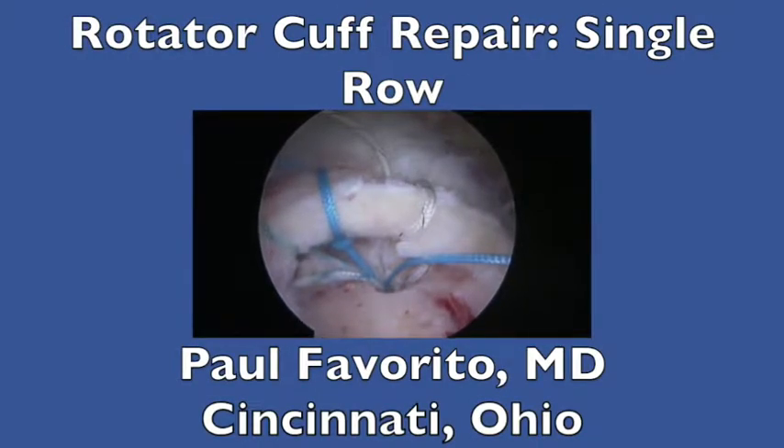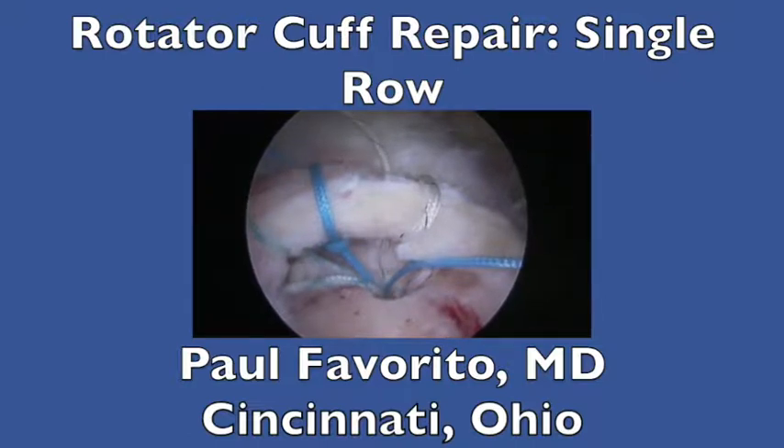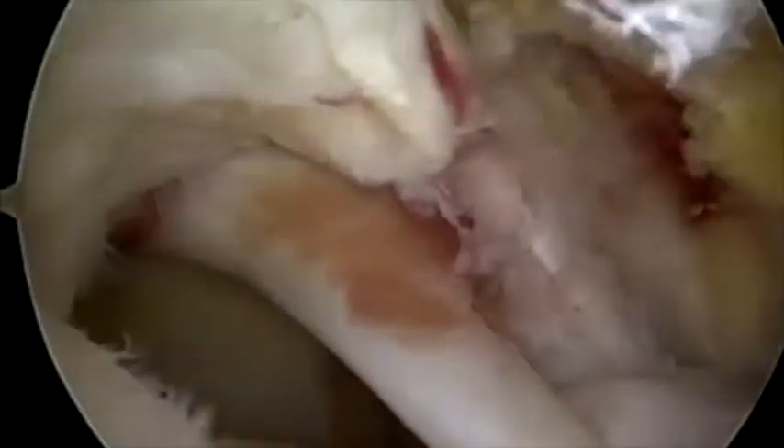This video will demonstrate the arthroscopic repair of a rotator cuff tear using a single row technique. The procedure is performed in the beach chair position. This is a lateral view of the right shoulder.